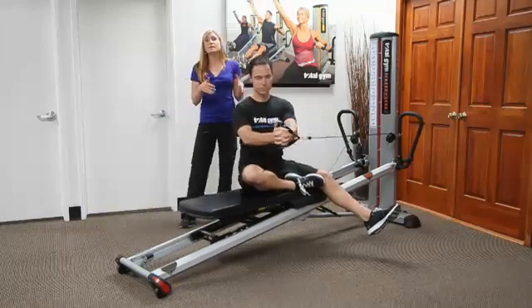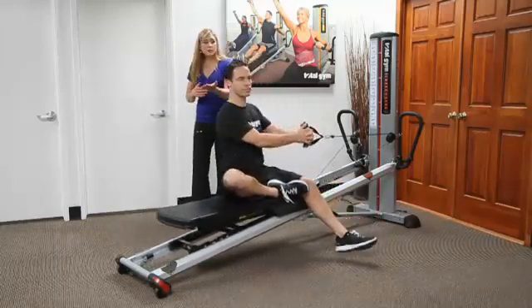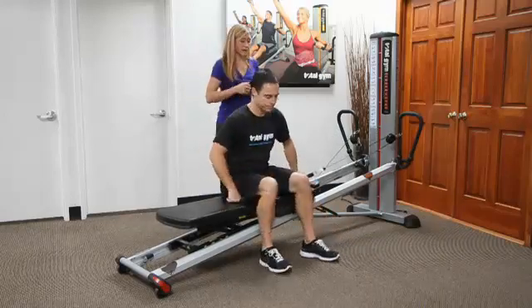So that's mobility and how to accommodate. The next thing is moving more toward the awareness section. I'm going to have him anchor and stand up.